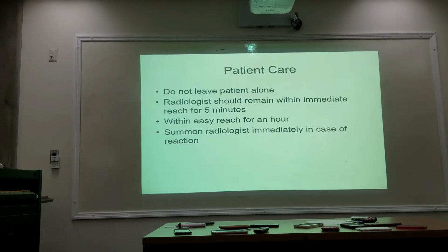So here's the variation. Now you're going to take pictures maybe every 15 to 20 minutes, maybe 30 minutes. Remember the small bowel series when it wasn't filling up, like every 20 minute intervals? We said once it goes past a certain hour, now you're doing it every hour or so.